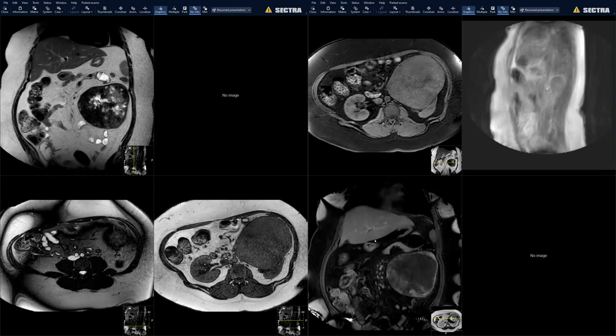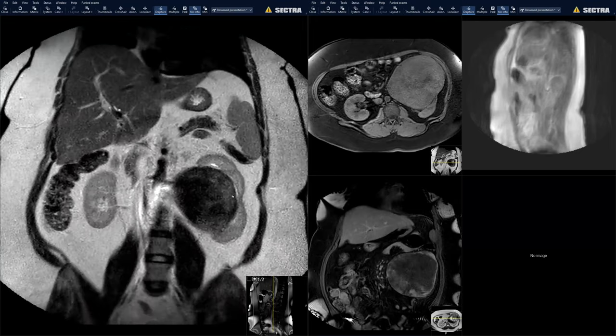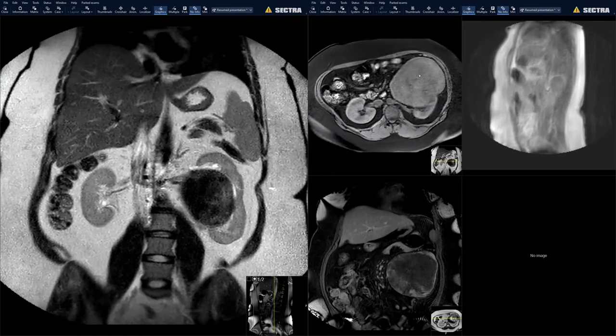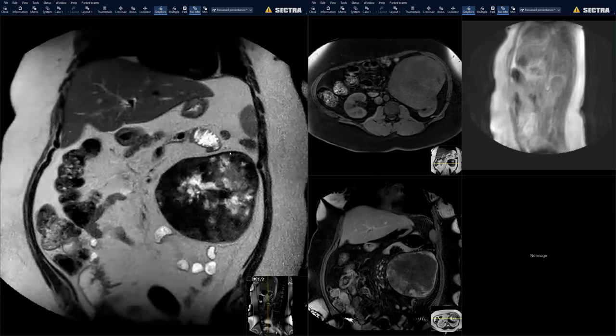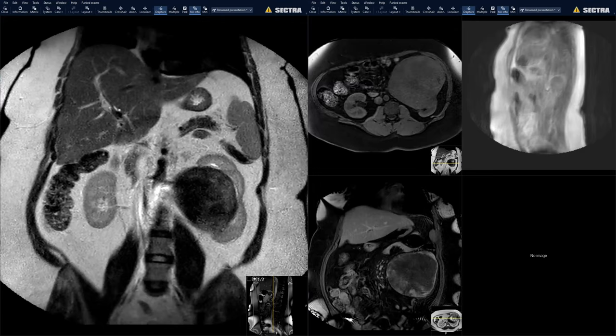I'll let you guys know. That'd be great. Are you going to biopsy it, or are they just going to remove it? I think they're probably going to just remove it. Because if you biopsied it and it was a fibrous thing, then you could save the kidney. To remove it, that looks like a total nephrectomy. Yeah, but it's in the hilum. Saving the kidney, I'm not sure, because it's going right into the renal pelvis. Actually, we are presenting this case tonight during the GU Oncology Conference, so we'll see what they say. Cool, let us know. Yep. All right.